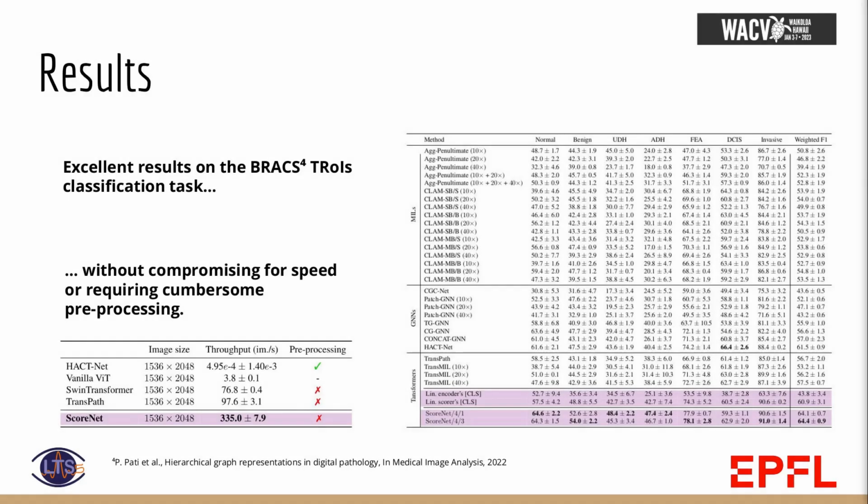Among other experiments, we tested the proposed method on a breast cancer histopathology classification task and reported excellent results. Most importantly, these results were obtained without the need of a pre-processing step and with an architecture having a significantly higher throughput than the existing methods.